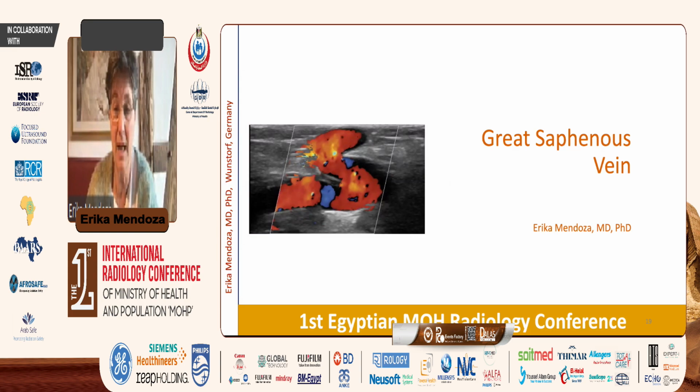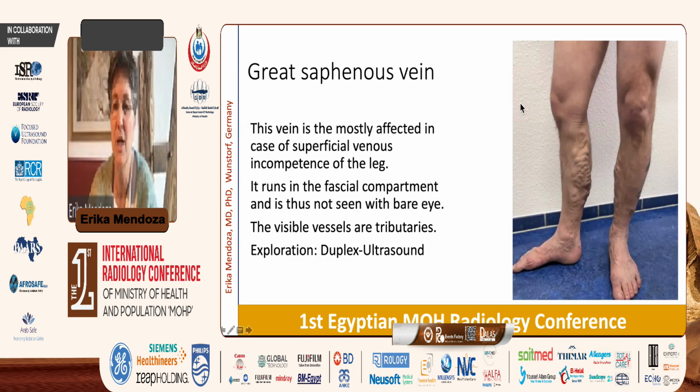Okay, now let's come to the great saphenous vein, because we are a little short of time, I know. And I want to show you a picture from the clinic. The great saphenous vein is the one running here. But these tributaries are not the great saphenous vein. The great saphenous vein runs inside a duplication of the fascia and can't be twisted like this. So this is always a tributary, and the great saphenous vein will be refluxing from the groin to here and then give off this tributary.